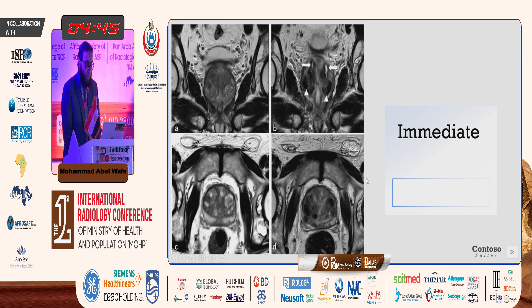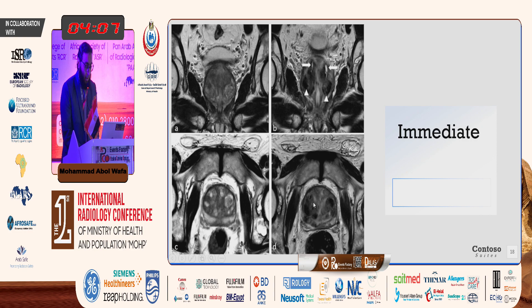MRI was done before the laser ablation. In coronal T2-weighted images, we can see the central gland. Immediately after the procedure, there is a track visible, and the hyperintensity is transformed to low-signal intensity due to hemorrhage. In the axial plane, we can see the hemorrhage in the ablated area.